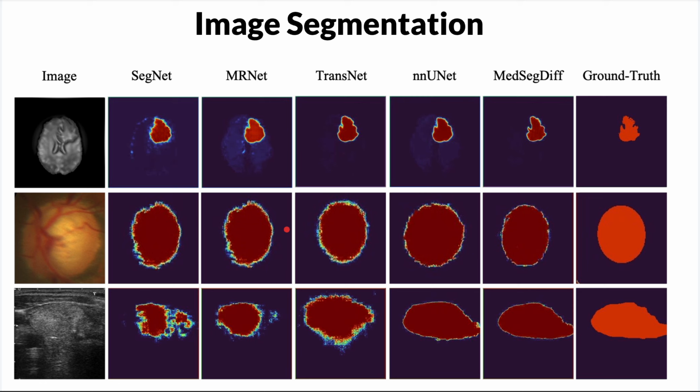All right. So the next one I want to talk about is segmentation. You saw the pre-processing, noise reduction, and image enhancement. These are the pre-processing steps. Once you pre-process, the next thing is you now want to segment your image. Segmenting, as we defined yesterday, is when you have an image and you partition the image into various regions.